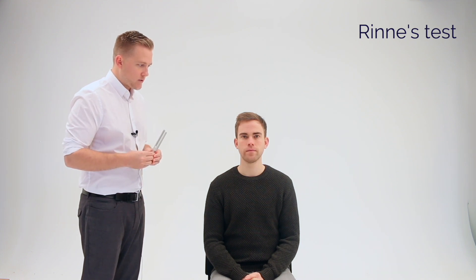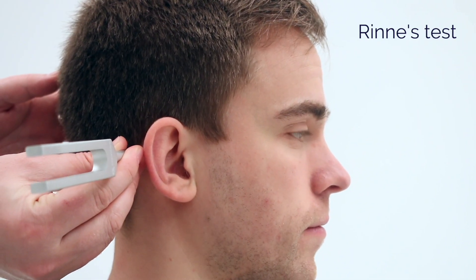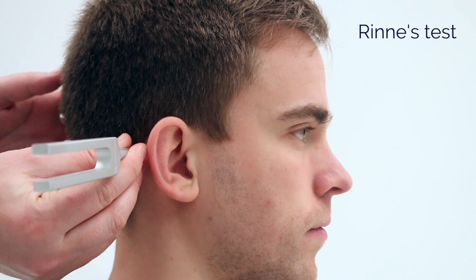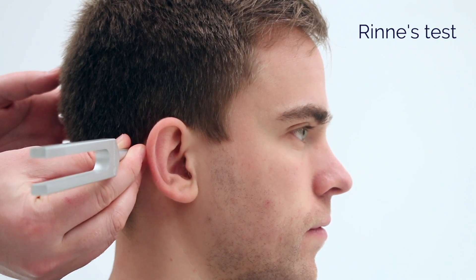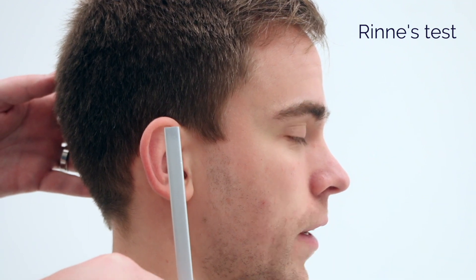I'm now going to place this tuning fork on the bone behind your ear. I'd like you to let me know when you can no longer hear the sound. I can hear that. And it stopped. Can you hear it now? I can.